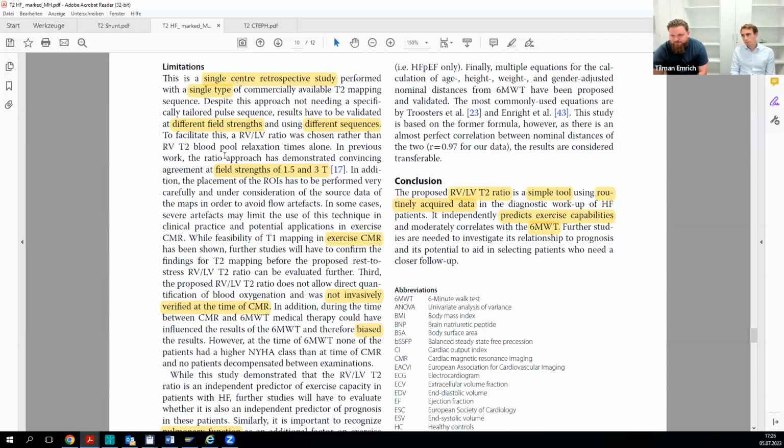Yeah. And then there were questions about the use of long axis versus short axis. So you briefly mentioned that it appears easier. You said that probably anybody can do a four-chamber view. I mean, a correct four-chamber view is maybe not that trivial, but I agree that everybody can see whether this is a four-chamber view or not. But were there other reasons why you chose four-chamber instead of a short axis, which many people are just more used to?